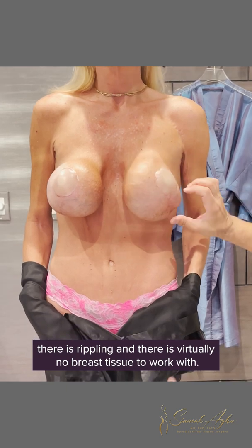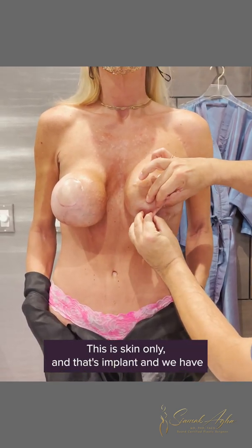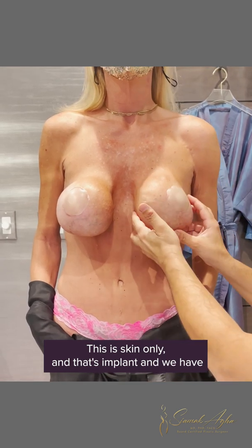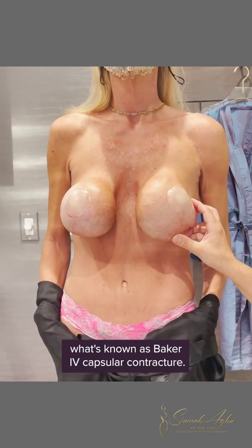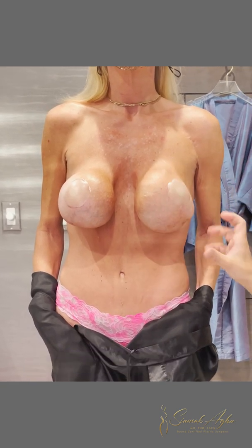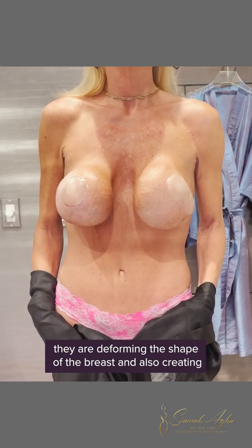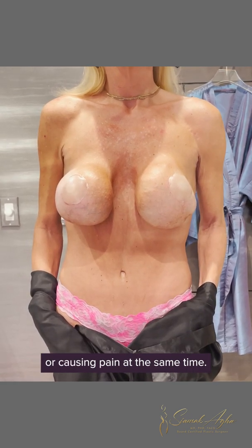There is rippling and there is virtually no breast tissue to work with. This is skin only and that's implant, and we have what's known as Baker IV capsular contracture — that's when the capsules are so tight that they're deforming the shape of the breast and causing pain at the same time.